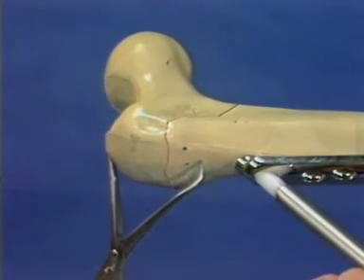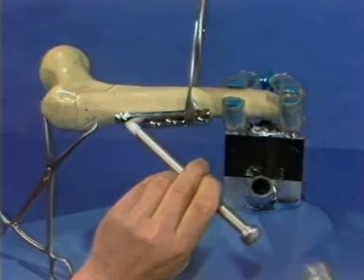The plate is impacted with the hammer and impactor, and concomitantly, the fracture zone is similarly impacted.